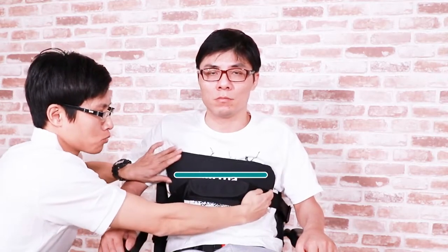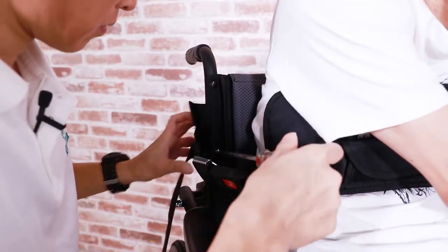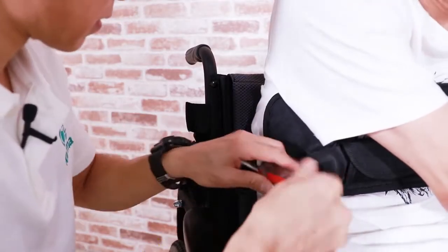Now, what is the right chest belt position? We draw a line between the 2 nipples like this. We can see the current belt position is obviously too low and cannot support the chest. Since everyone has a different height, we use this bolt to adjust the height of the chest belt.